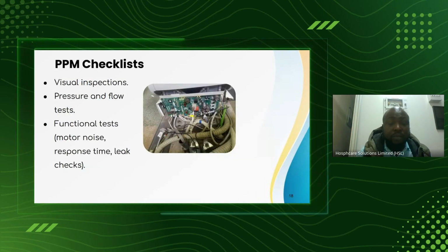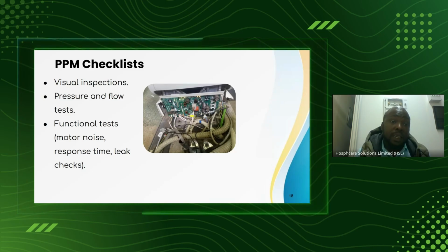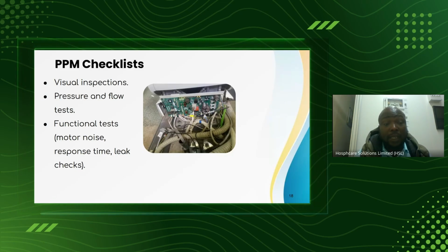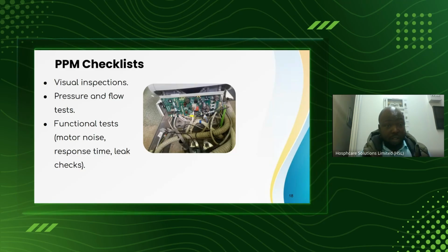So what do we check? You can check your tubings for leaking. You can do leak tests. You can check your pressure gauges if they are normal by visualizing the operation pressures. Remember, we have an operation pressure gauge at the delivery point.